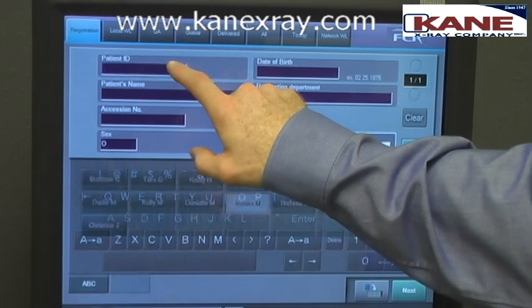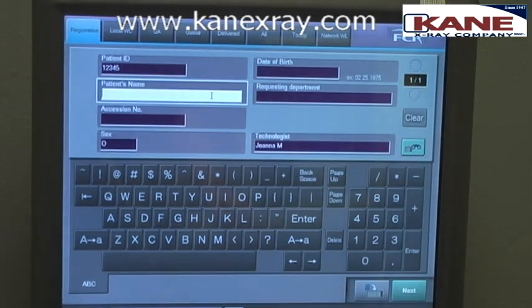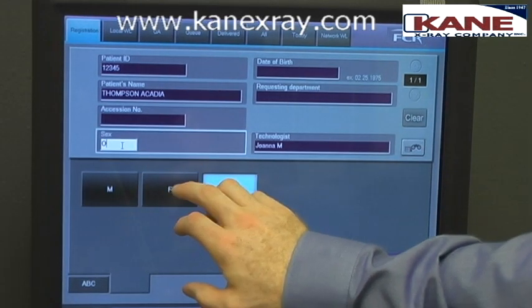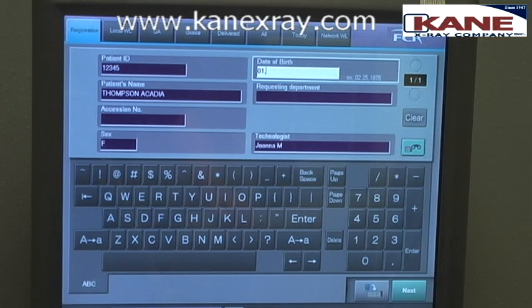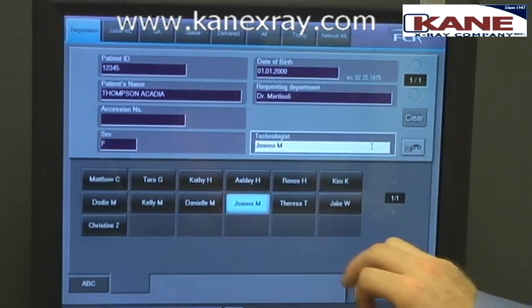For example: patient ID is again a unique number from the practice management software for that patient. Patient name would be the owner last name, space, and then the pet name. Sex would be male or female. Date of birth, again just like the example, MM.DD.4Ys. Requesting department is whichever doctor ordered the exam, and technician is whichever tech is taking the exam.